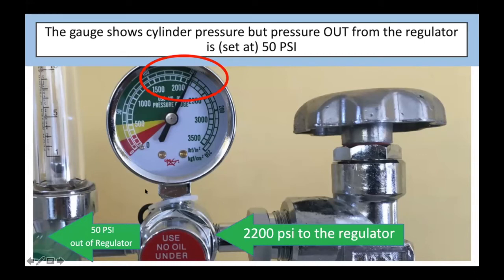You see the gauge is still maintaining the indication of the pressure in the cylinder. It does not indicate the pressure going to the flow meter.